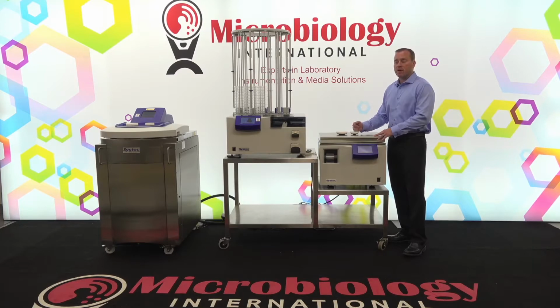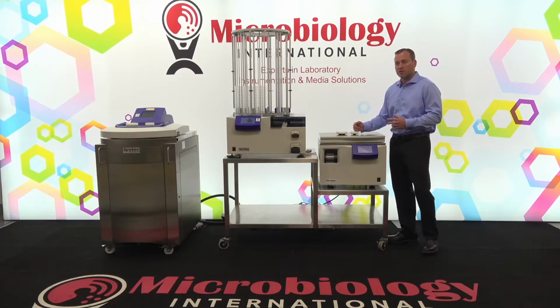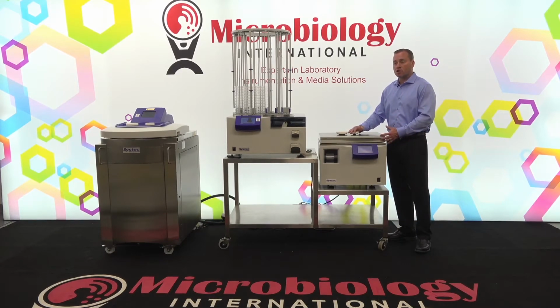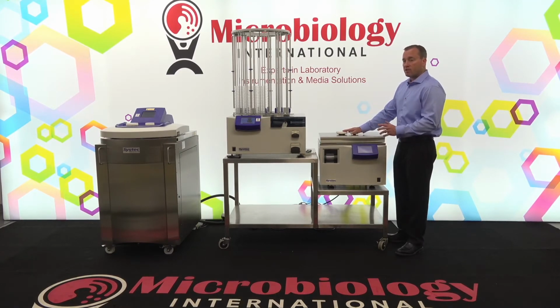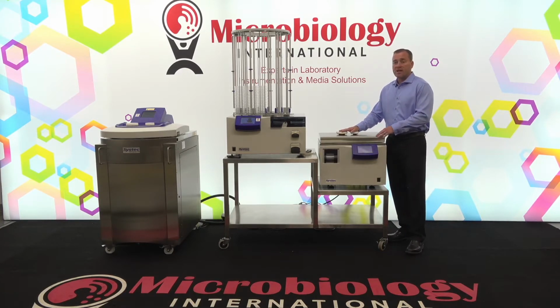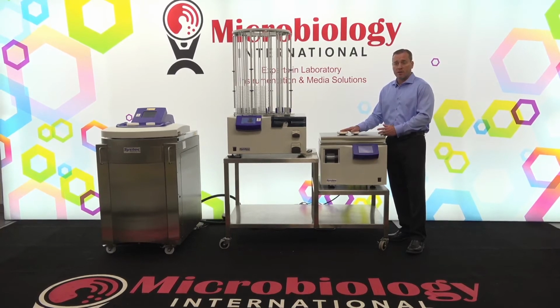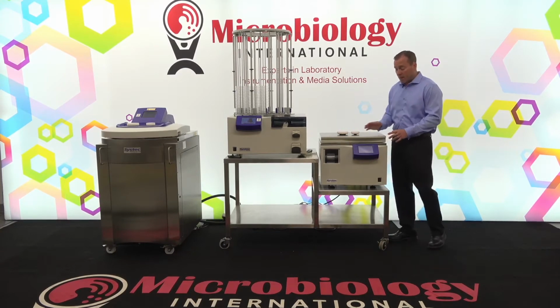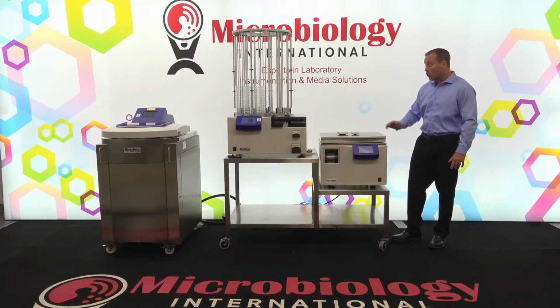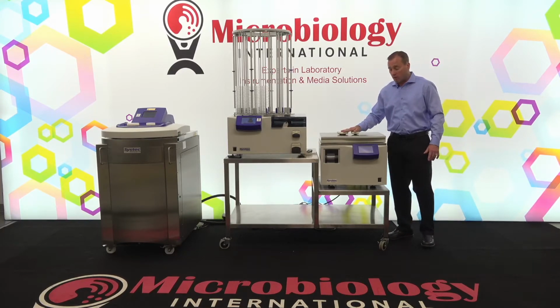The 10, 20, and 30 liter systems are all built on the same chassis. Them being built on the same chassis basically means that as they get larger, they just get taller. So the 10 is the only benchtop model. Then we would have a 20, which is just a bit taller, and then a 30 as well. The minimum volume for the 10 is 2 liters. So it's either 2 to 10 liters with the 10 liter system, 2 to 20, or 2 to 30, depending upon the size that you pick. Again, the 20 and 30 are floor models, so they would be on casters and located on the floor, whereas this would be our benchtop model.